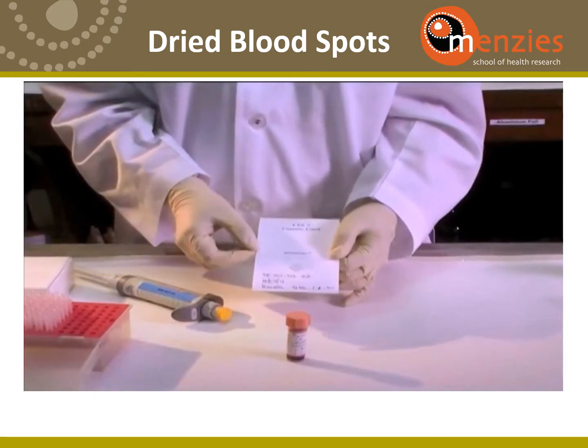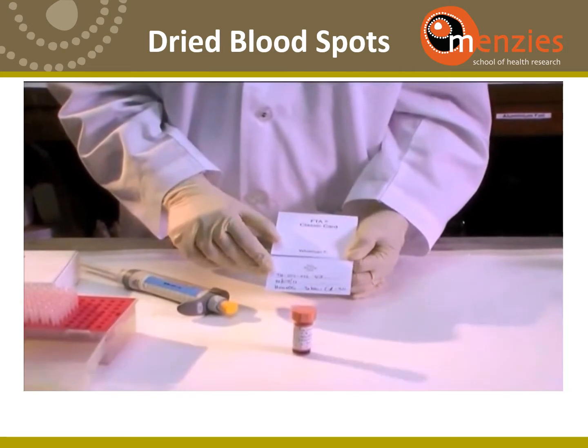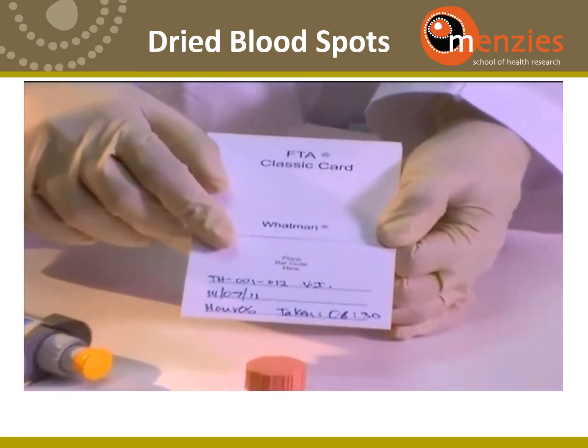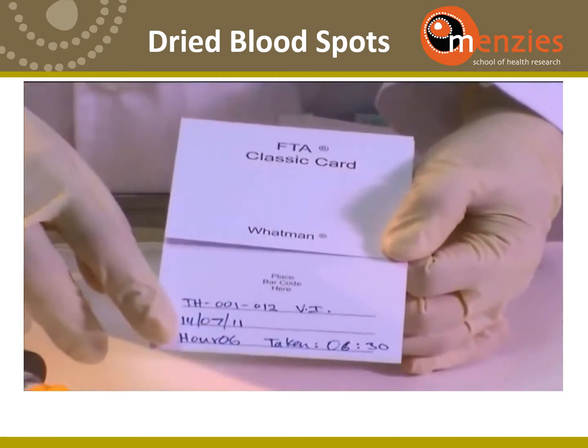First, you label the card clearly with the study ID, which is provided by the study PI, the date and the time.